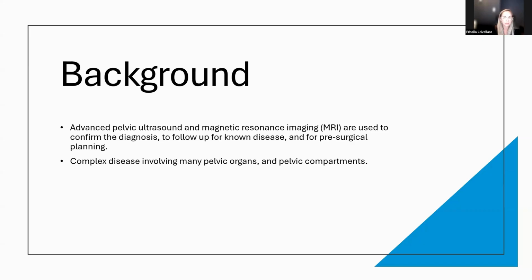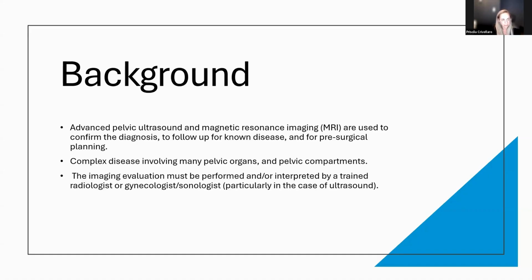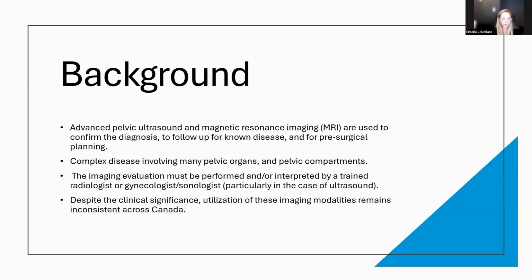It can involve the bladder, the rectum, go even beyond the pelvis. So we do have to know what we are dealing with before we go for surgery, ideally. And because it's such a complex disease, the imaging evaluation must be performed by a professional who was trained, either a radiologist or a gynecologist and sonologist in the case of the ultrasound. So you do have to have training to identify the findings. They might be very subtle on MRI or ultrasound.